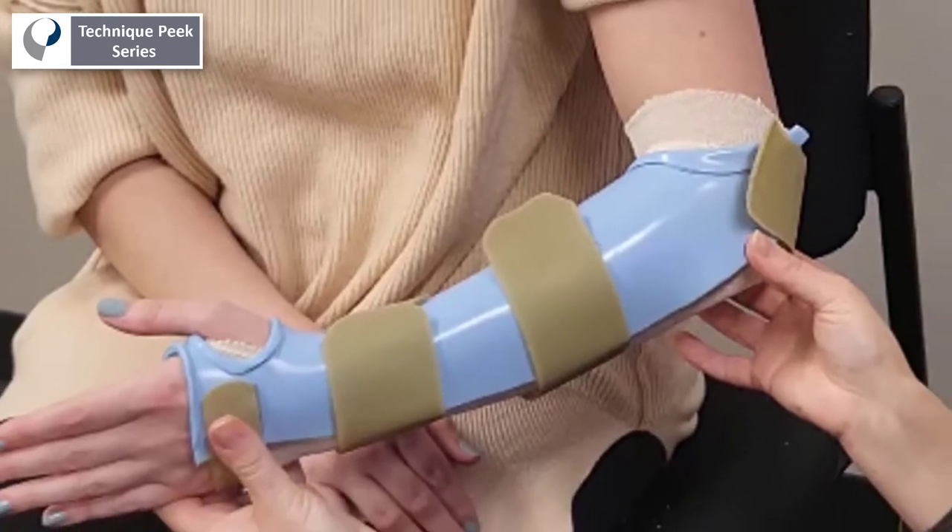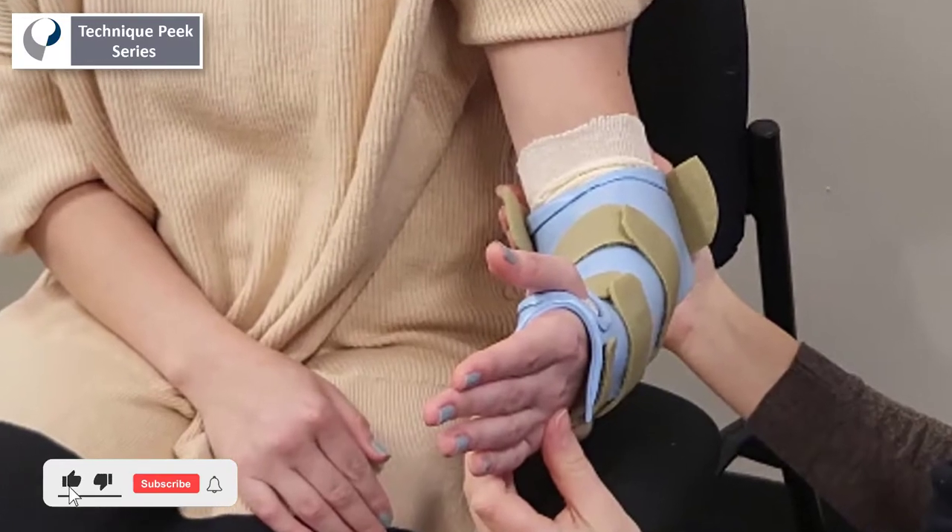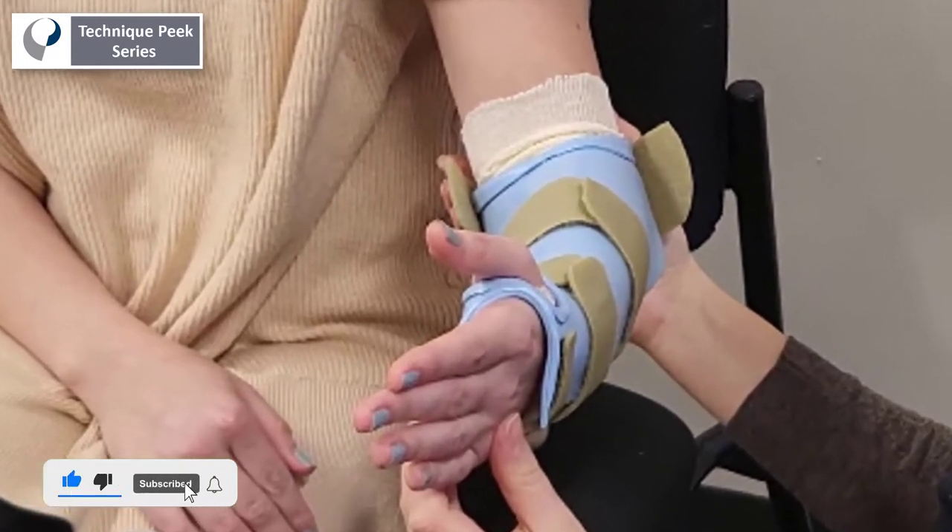Today we're going to go over a step-by-step process to fabricating a Munster splint. This splint is designed to prevent forearm rotation and wrist range of motion.